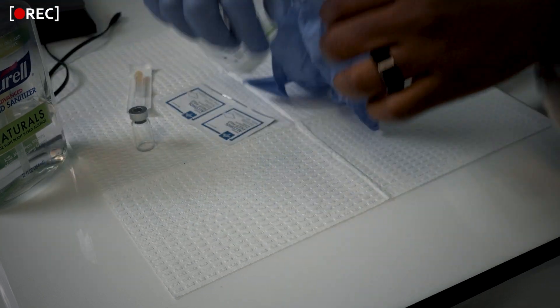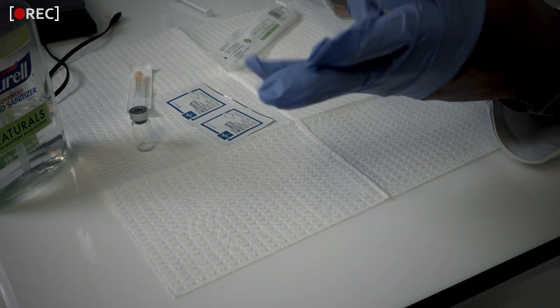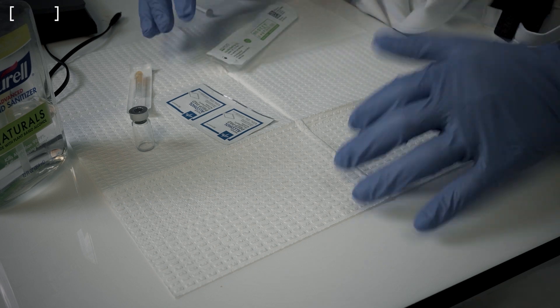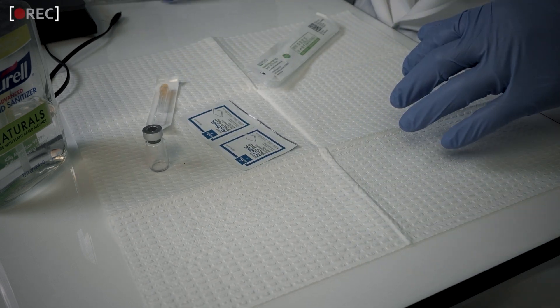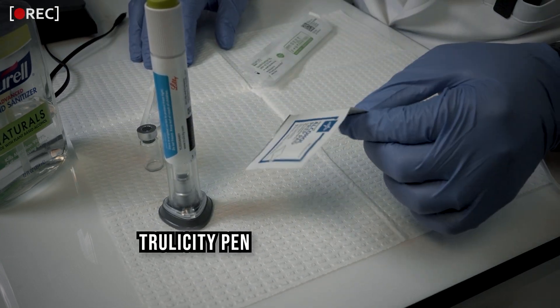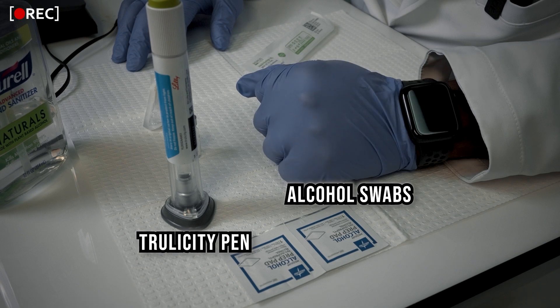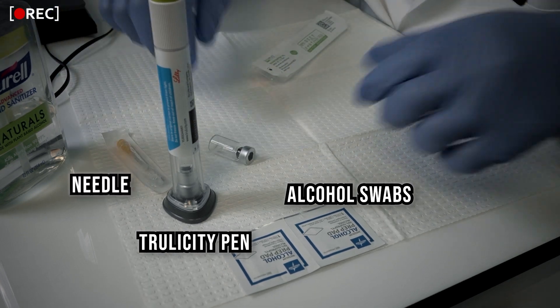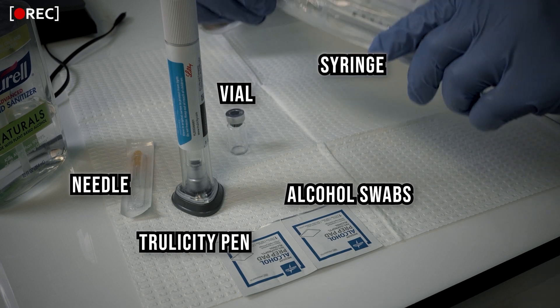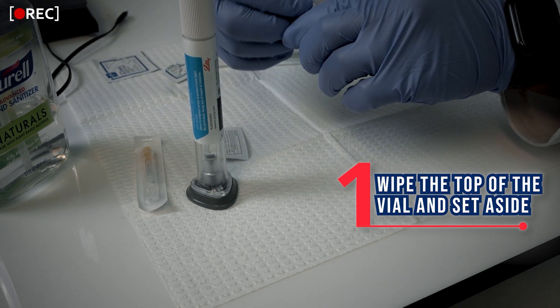Put on gloves — make sure your hands are dry first or the gloves won't slide on easily. If you're doing this at home, washing your hands thoroughly is sufficient. Take the Trulicity pen, open an alcohol swab, and wipe the top of the transfer vial — even though it came clean from Amazon, you still want to wipe the top before injecting through it. Set it aside.